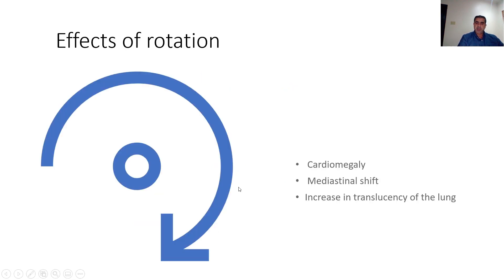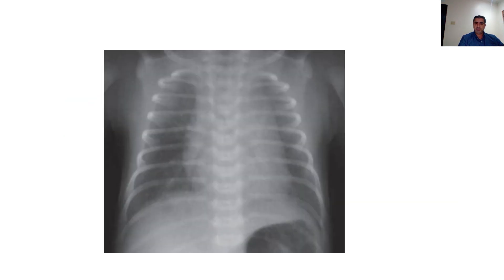The problems of rotated films include false cardiomegaly, mediastinal shift, and increased translucency of the lungs. Here is an example of a well-centralized X-ray. We use the lower part of the ribs to judge centralization: draw a line in the midline, then a line from the midline to the inner border of the ribs on the left side, and again on the right side. If the two lines are equal, the X-ray is centralized.